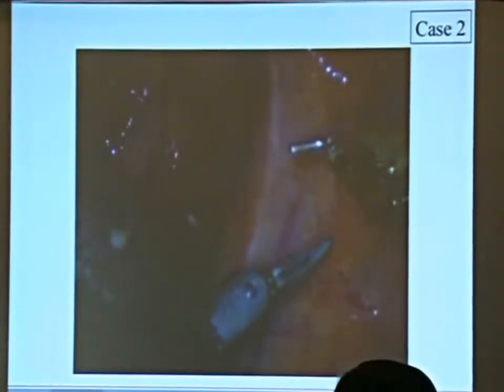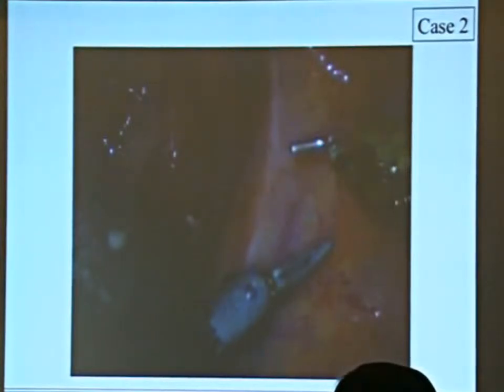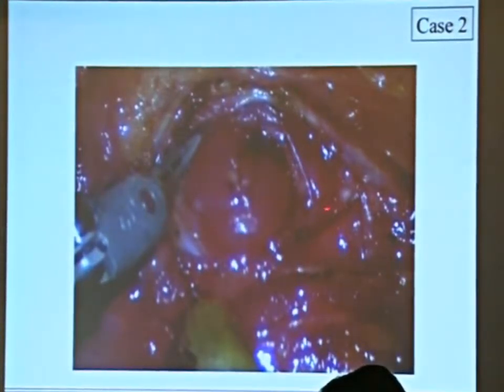You may imagine here, we saw a gray wall after the sternotomy. Nothing was normal in the mediastinum, but we were encouraged by the measurements to go on into this area, and as you can see here, 2.5 centimeters of distance, and then we exactly found the gland, which was not very large, so you could not palpate or indirectly palpate that, but you had to find it, and it was a straightforward operation because of those measurements and the diagnostic and ectopic 5th gland in that case.